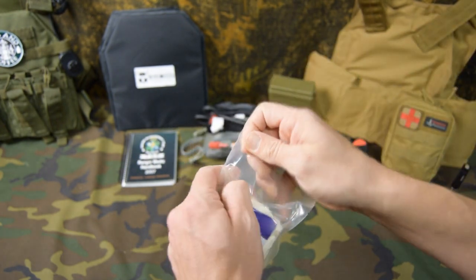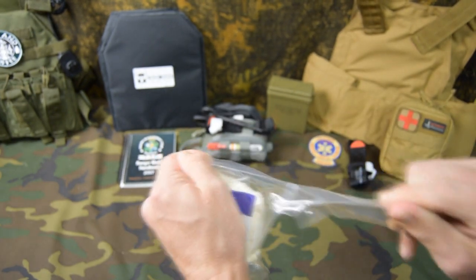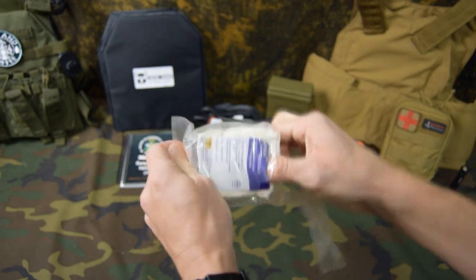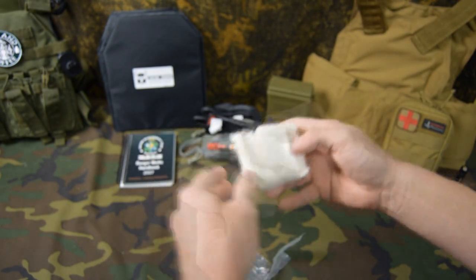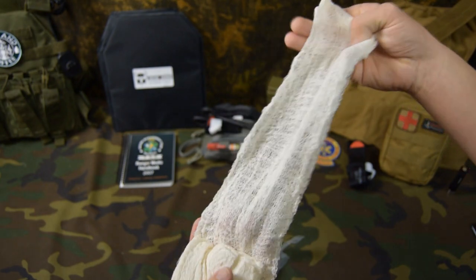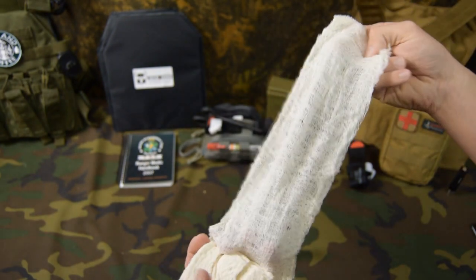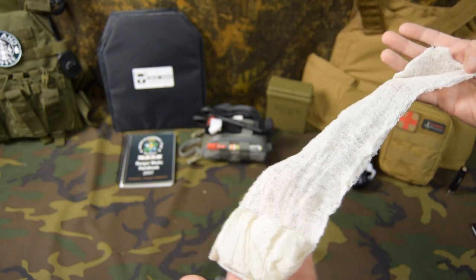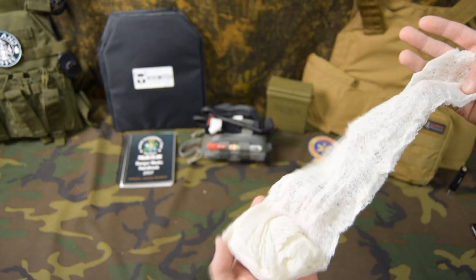But if my hands are dry, obviously it tears fairly easy, just like that. And then we can reach inside and pull out our gauze. As we open up the package, you can see this is basically just a cotton cheesecloth. There's no hemostatic agents on this, it's just a cloth. And it's not a Z-fold either, like some of the other items you'll see — it's just a roll.